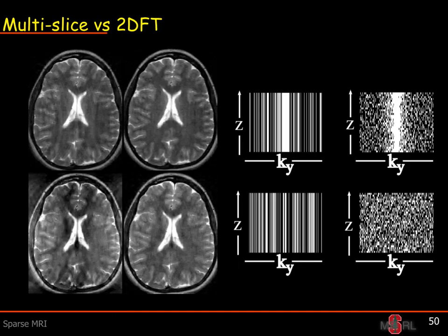And for multi-slice acquisitions, it's really much better to use the variable density different sampling patterns on every slice, as you can see. So that's this pattern here versus using the same pattern on every slice. So here's a matrix of images that's obtained using each undersampling scheme here. So here's variable density with the same patterns, uniform density with the same patterns, and completely random sampling. And you can see that overall, really, the variable density with different patterns on different slices wins here.